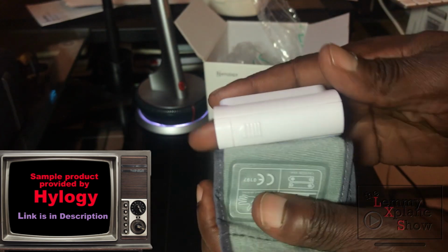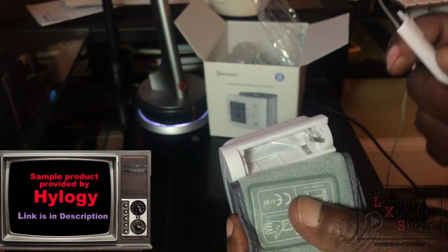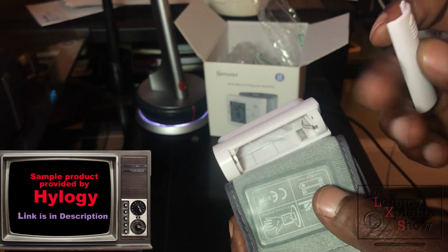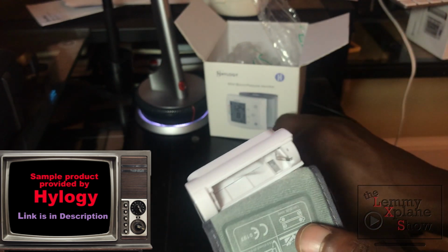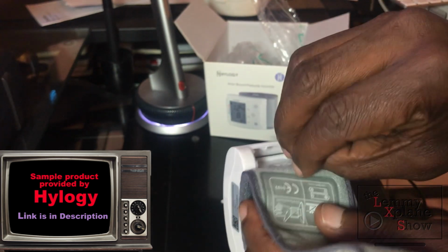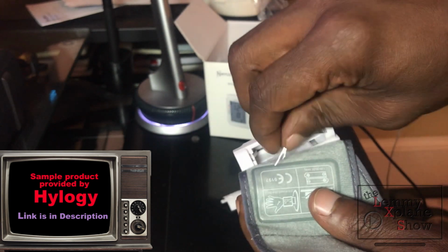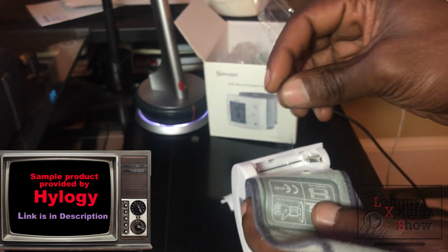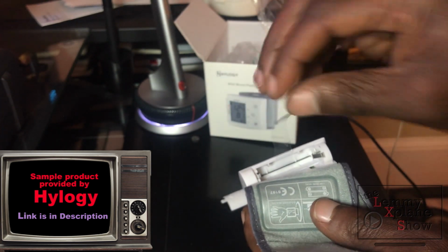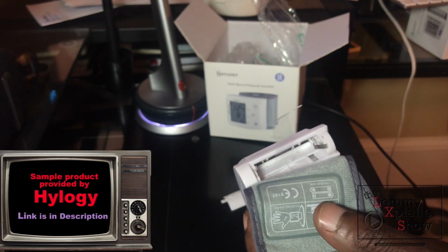So I'm trying to figure out how to do the batteries. So it's over here. Slide that. Compared to the thermometers, this does feel a little light in the hand, the battery case cover, I mean, but it's not such a big deal. And this is your plastic to retrieve the battery, so don't yank this out. You will need this later, this piece of plastic. Obviously, if you've used batteries before, you'd know.